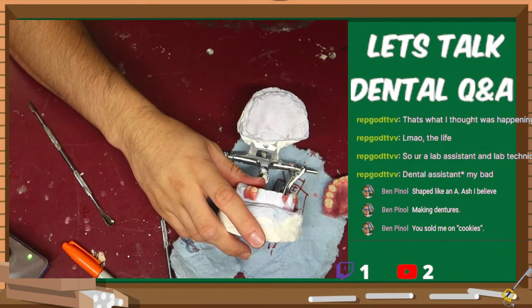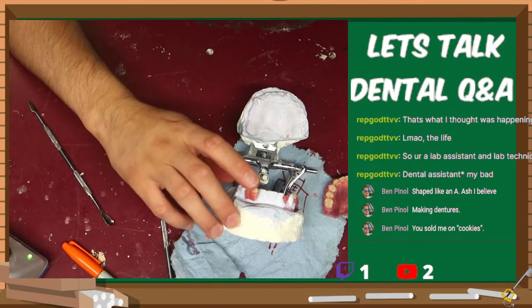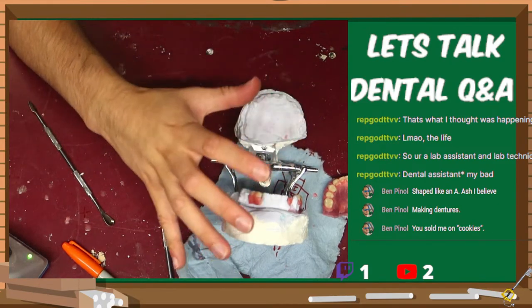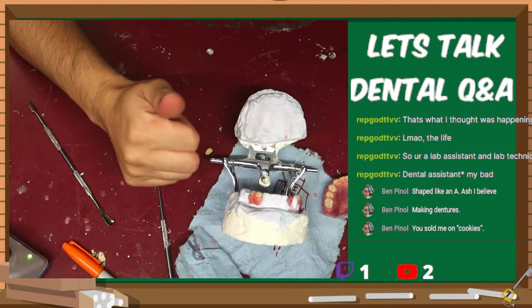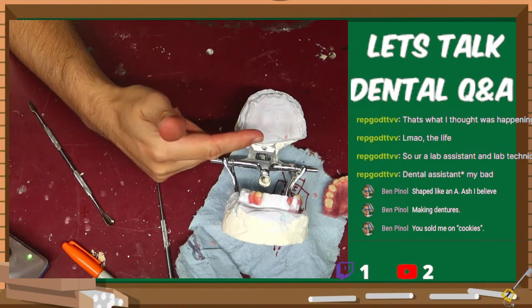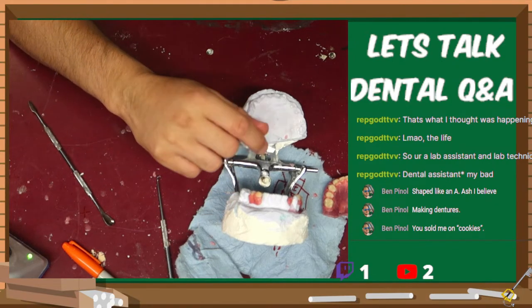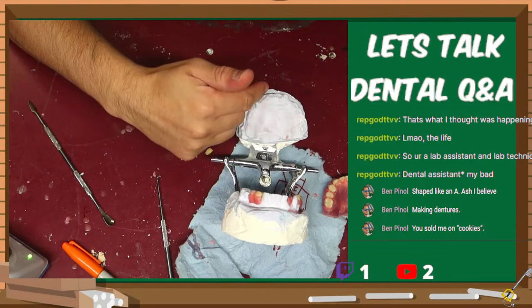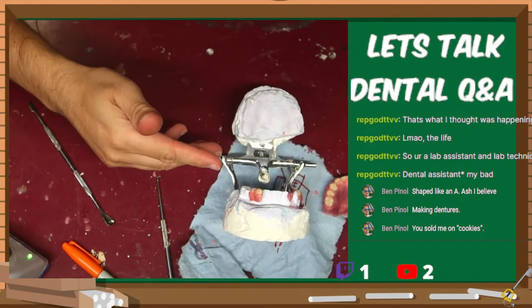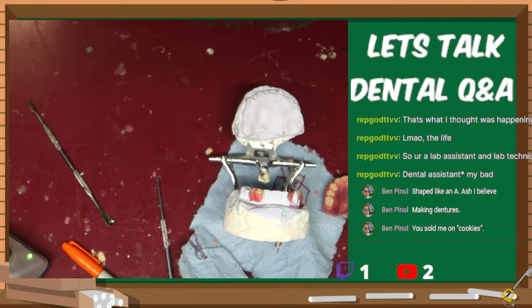Like we were talking about earlier, for me to do my job, I need to have decent impressions. That means either the dental assistant took the impression or the dentist took the impression, but most importantly, whoever signs off on that impression and sends it to me, that person's responsible for whatever I get here, whether it looks great or it's garbage.